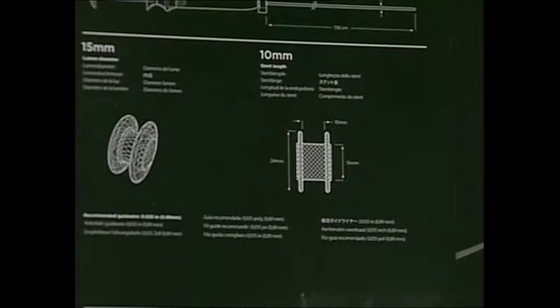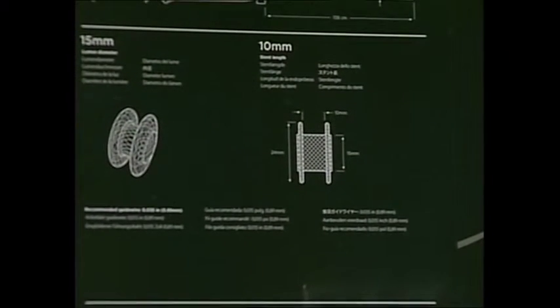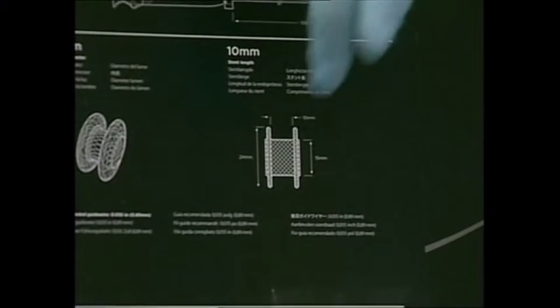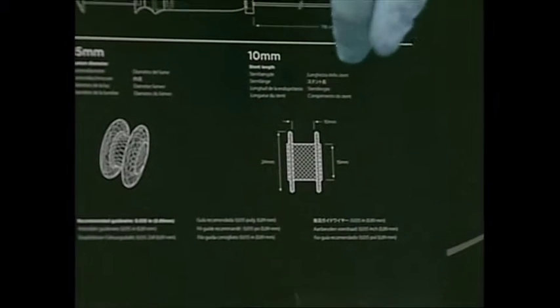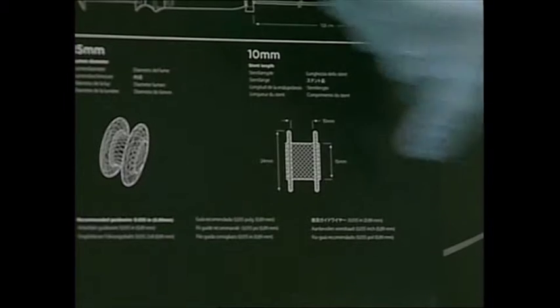Now in the gallbladder, it's not an issue because it's very capacious. If you're in the bile duct, then of course you're going to need to select a stent size or a flange size that will fit in the lumen. In the bile duct, of course, you have a more constrained lumen.